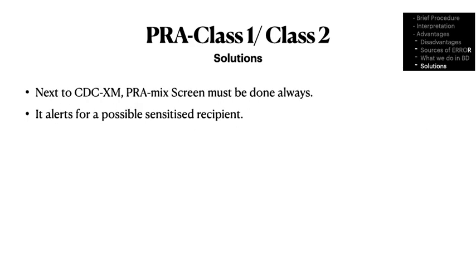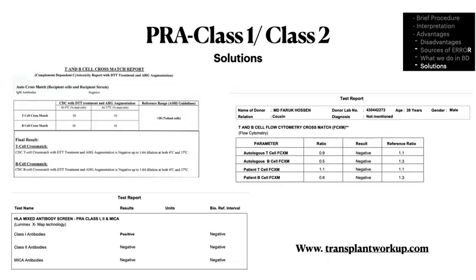So how do we solve this? Next to CDC cross match, PRA mix screen must always be done, and as I told you, it's extremely easy to set up, especially when you have a Luminex platform available. We just have to buy the kit and use it. The training is minimal, so it's easy to implement, and it alerts for a possible sensitized recipient. I'll show you a patient I saw the previous day.